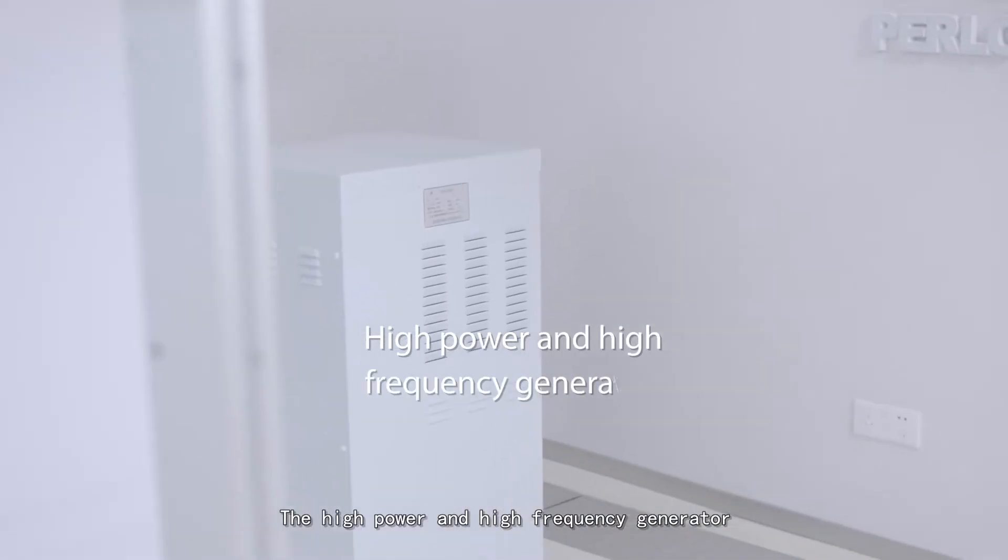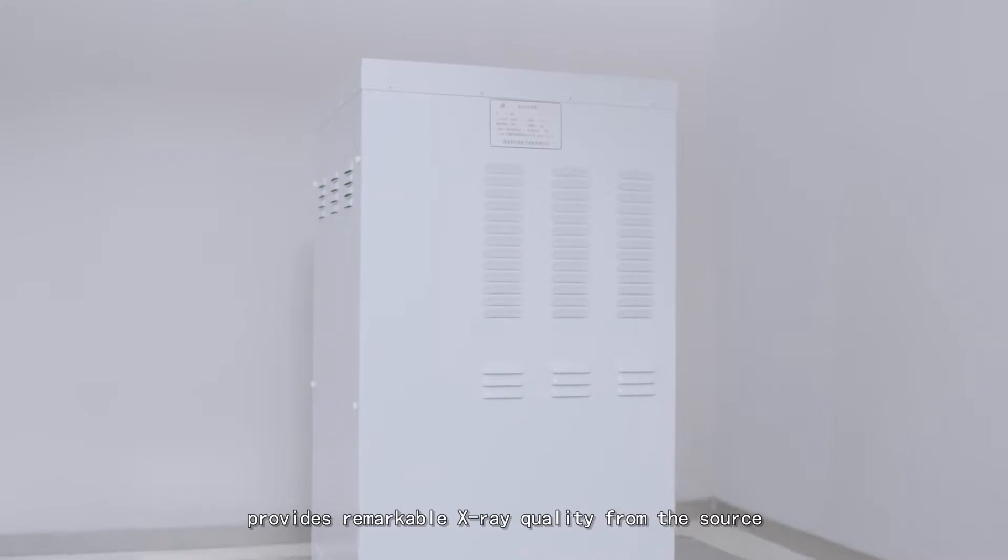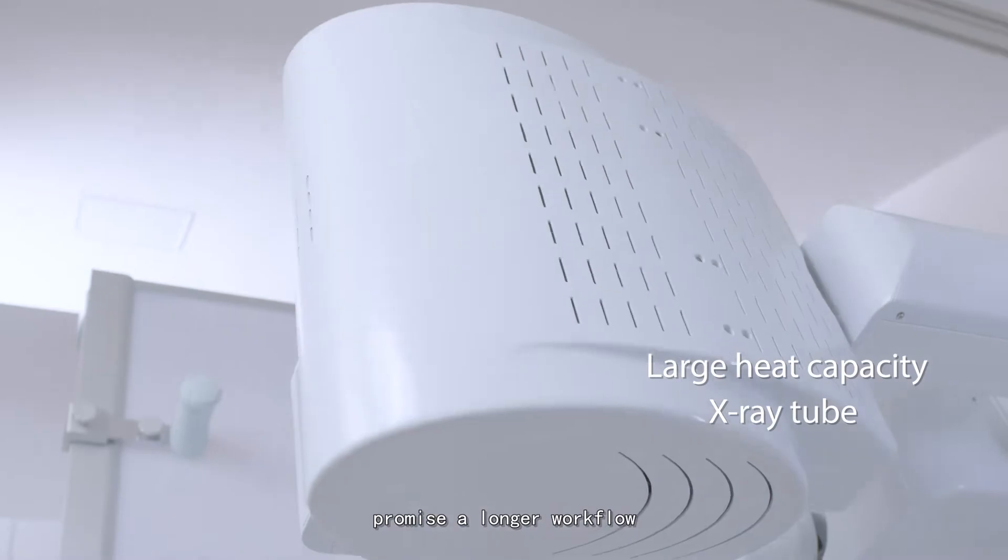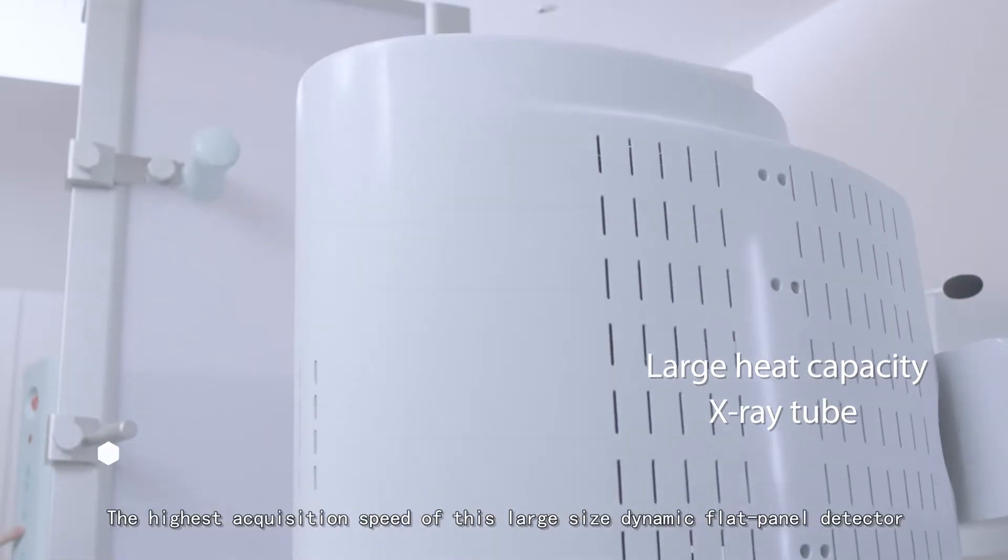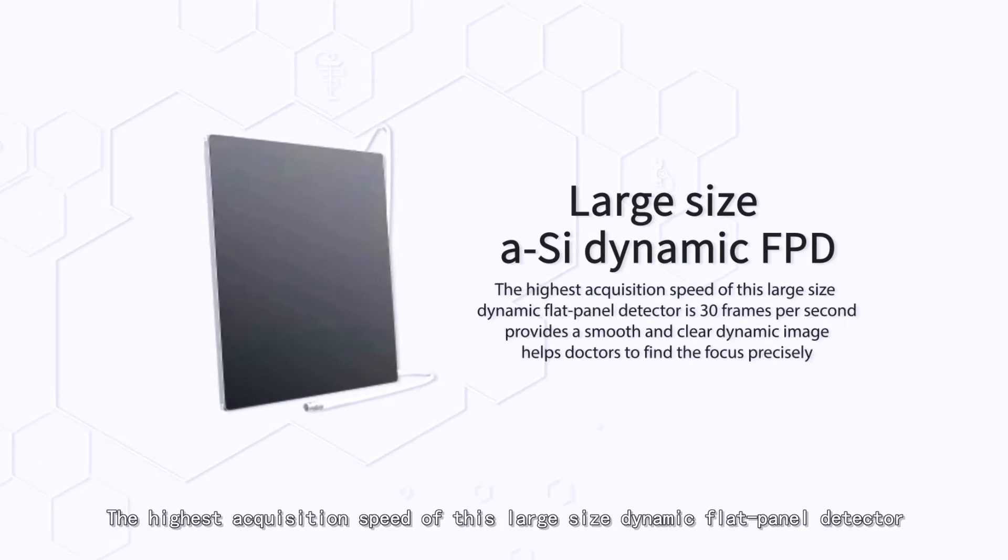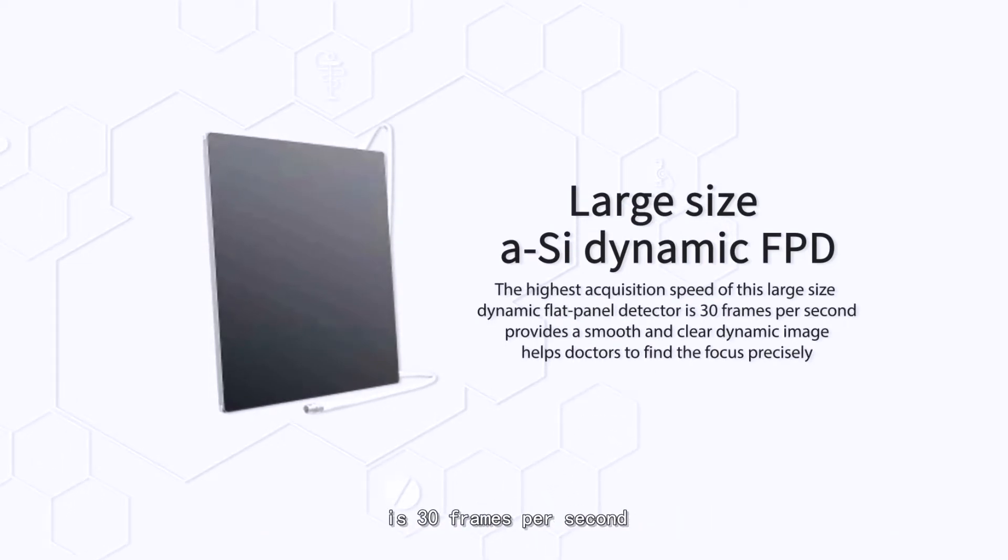The high-power and high-frequency generator provides remarkable X-ray quality from the source. Large heat capacity of X-ray tube promises a longer workflow. The highest acquisition speed of this large-size dynamic flat panel detector is 30 frames per second, providing smooth and clear dynamic images that help doctors find the focus precisely.